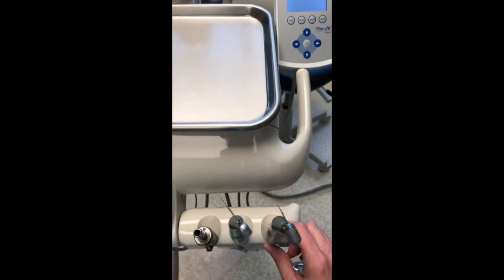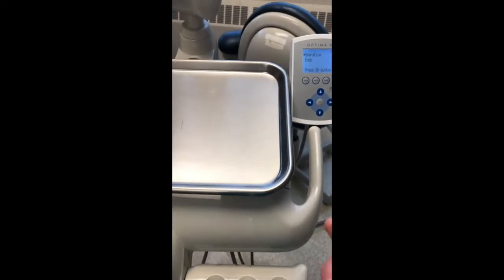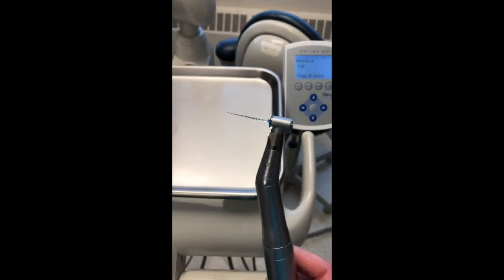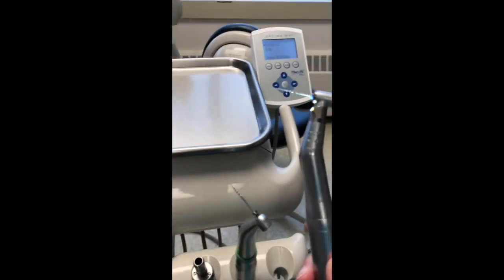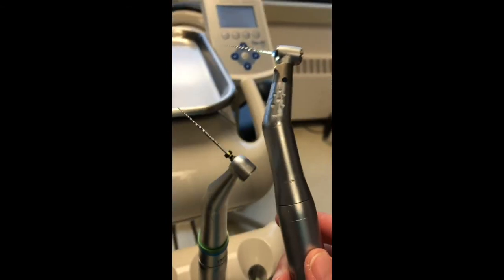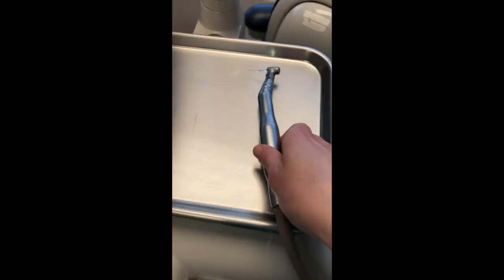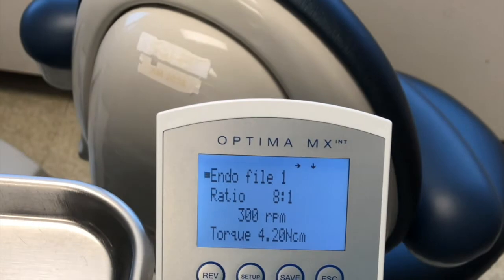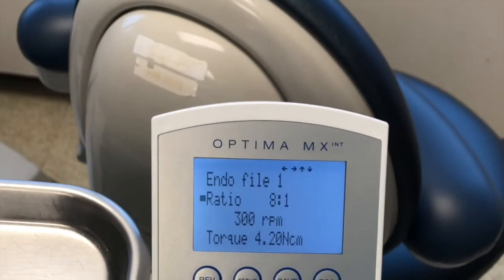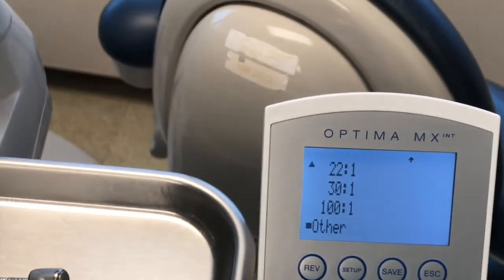Next I'm going to show you how to set up the 1-to-1, if that's the only handpiece you have. This is a 1-to-1 — as you can see, the head is a lot bigger than the 8-to-1, which makes it a little more difficult to see when doing endodontic procedures. If you come over here, you can select endo. The ratio you're going to want to select — you can see it says 8-to-1, but that's not what we have. We want 1-to-1.